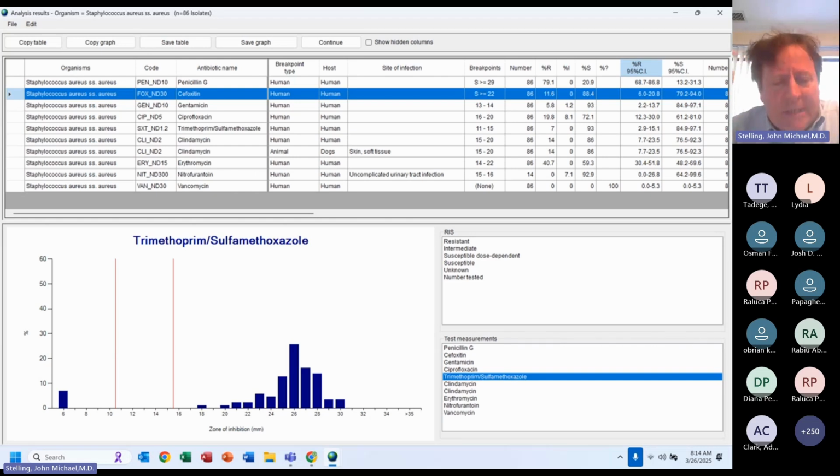But if the patient has meningitis, a little bit of resistance can kill the person. So people wonder, why is there a meningitis breakpoint and a non-meningitis breakpoint if it's the same bacteria? The reason is not the microbiological difference. The difference is the therapeutic difference.